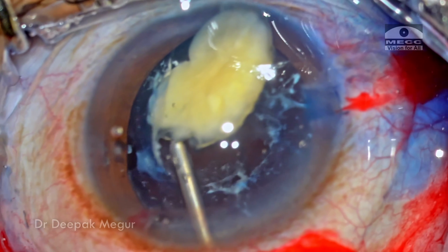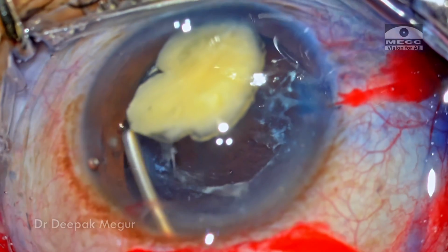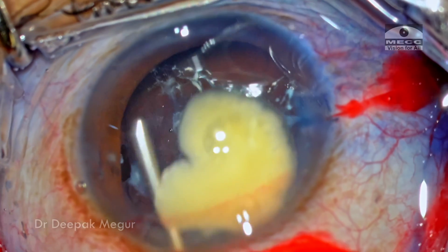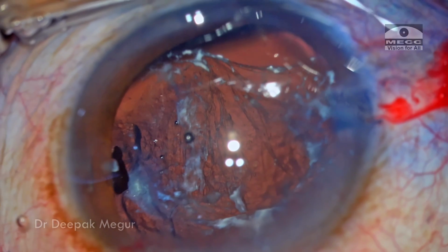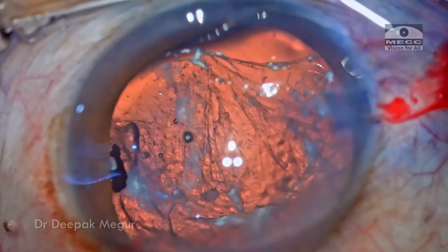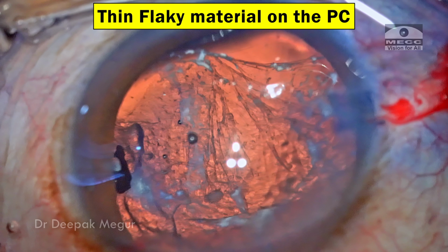So under the cover of the OVD, the nucleus is gently manipulated out of the torn bag into the anterior chamber and it is then expressed out. Now, having a closer look at the bag, the entire bag looks to be very thin, flimsy, and the posterior capsule has a lot of thin, flaky material which might not be possible for me to remove in totality.